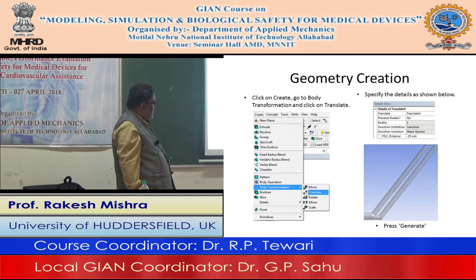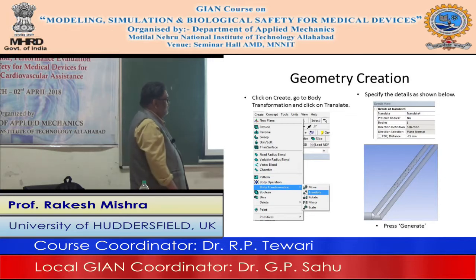So this one artery, one bifurcation without any stent, one bifurcation with stent. These two are exactly the same diameter, and we can compare the performance of the flow in this artery or in this artery. Okay.